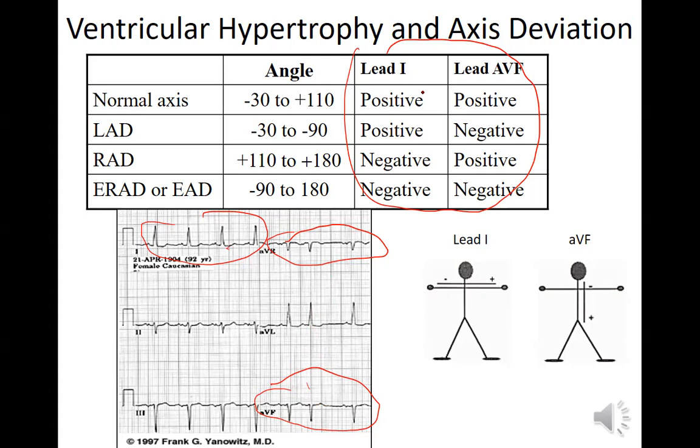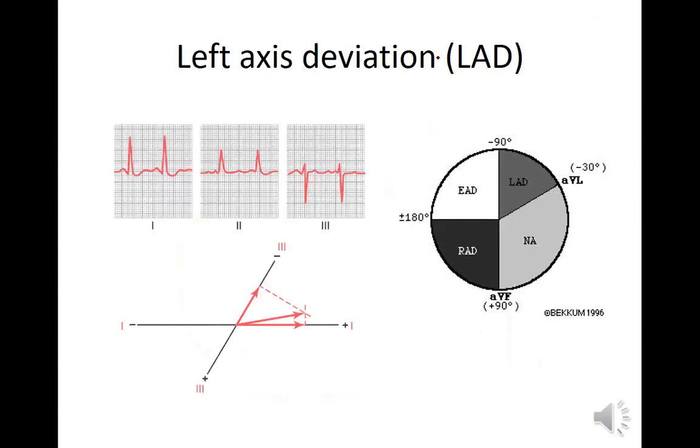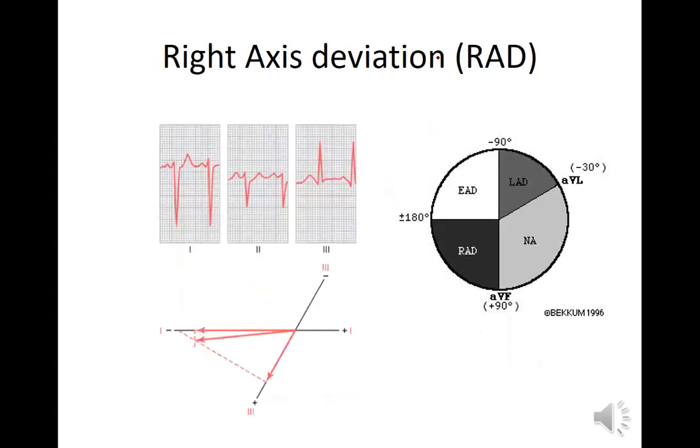You could memorize this, but understanding it really goes a long way. And then doing the drop line thing would be great too. But again, do we have the time for that? We're going to mess it up. We'll spend half a lab just learning how to cut the paper. So just remember the thumbs and these leads for axis. Limb leads. And here, skip page 53. Don't even look at it, rip it out of your book. I don't care. But forget about these pages here too.